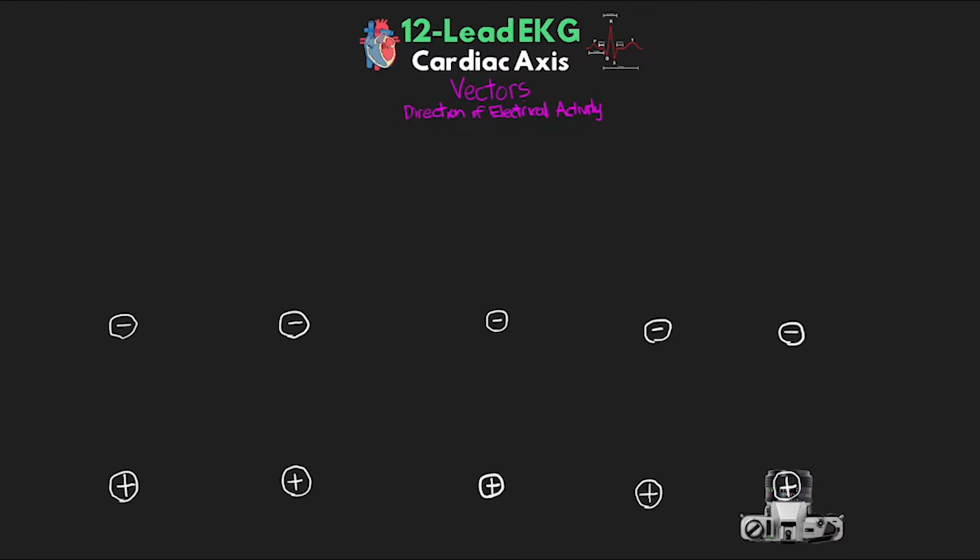Before we get into determining these cardiac axes, let's review some concepts that play an important role in this process. I did discuss these in previous lessons, but it'll be helpful to refresh that here and apply it to what we're doing. So first, we're going to be talking about vectors, aka the direction of electrical activity. Remember that if we have a positive electrode, this is where we're looking from. Think of a camera that's on the positive electrode looking towards the negative electrode.